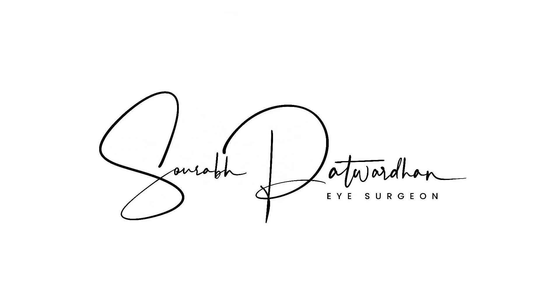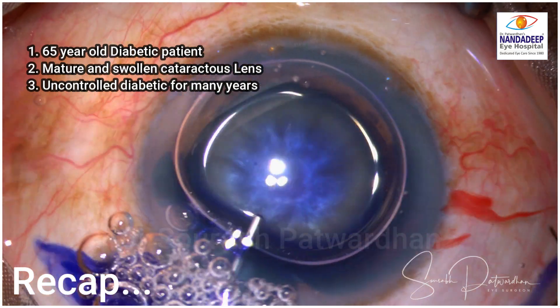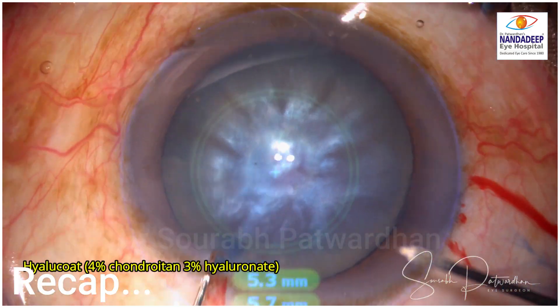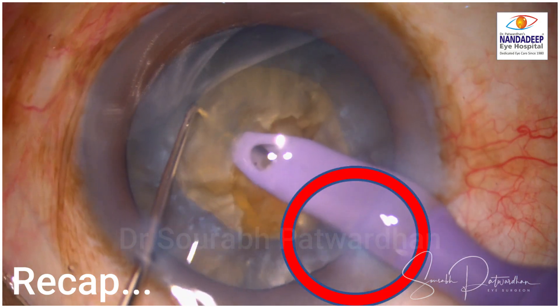Let's just recap what happened in this case so far. This was in my previous video where I discussed about the right size of capsulorexis. This was a diabetic patient with swollen mature cataract. I did a rexis of around 4.6 to 5 mm, and when I was chopping the nucleus, I felt that the leathery nature of the cataract and excess stretching led to this anterior capsular tear.